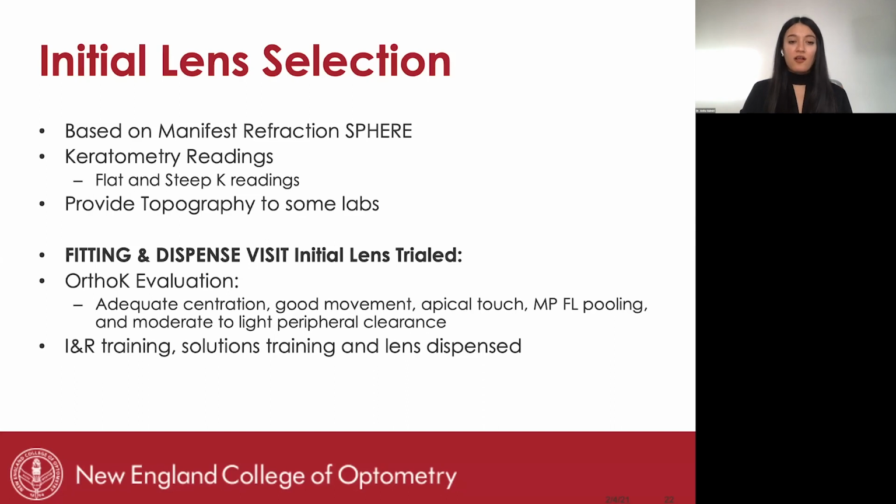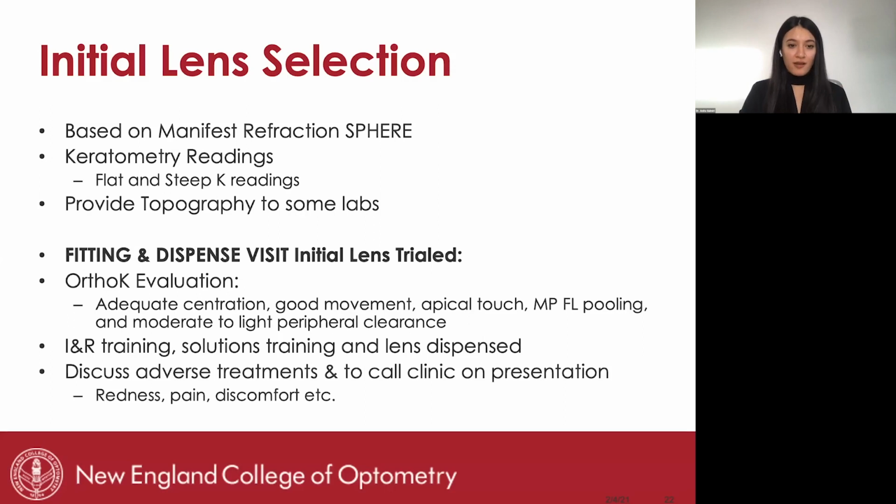If the child is young, like I mentioned, anywhere between 6 to 8 years of age, we do tend to involve the parents heavily. We make sure that the parent, even if the child has gotten the insertion removal okay, also knows how to remove the lens. And we use small DMV plungers for the removal technique.